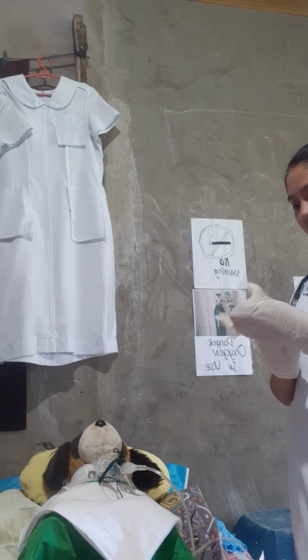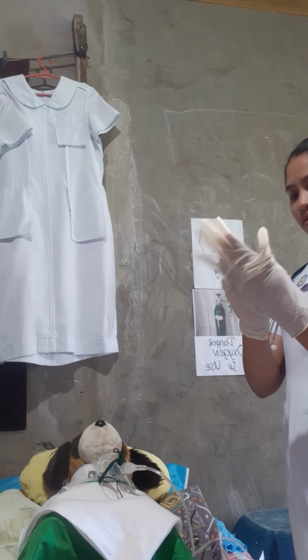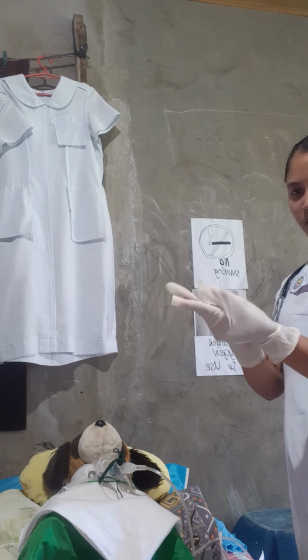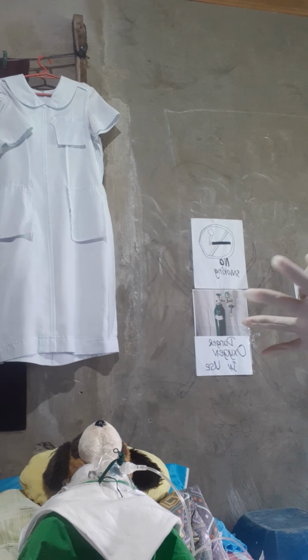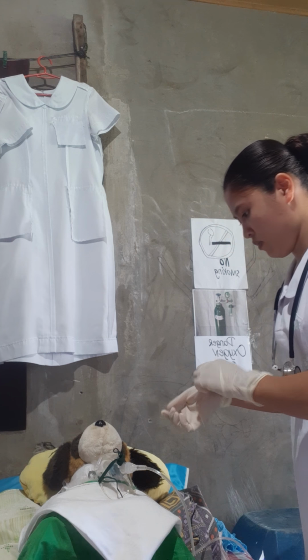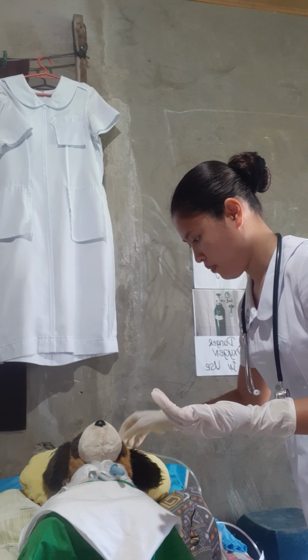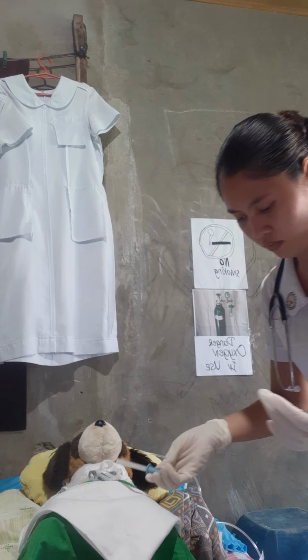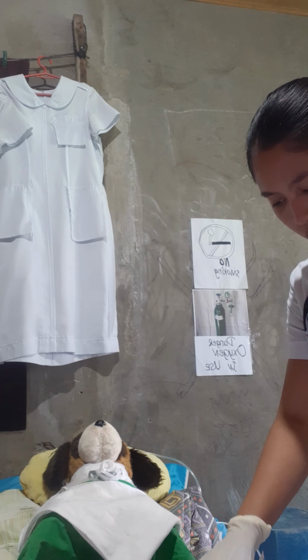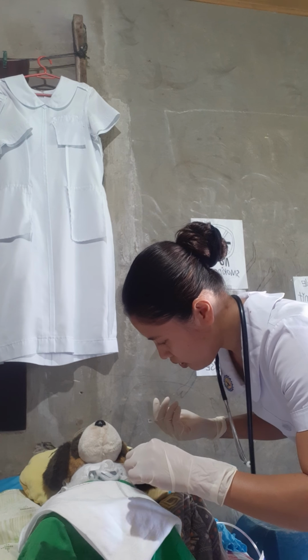And we need to remove this one again, and this one. Then, with the applicator, we need to clean.